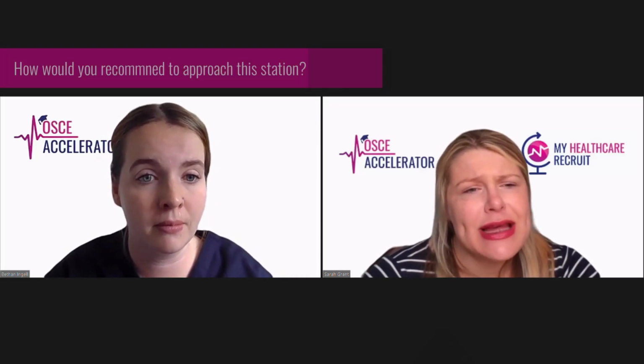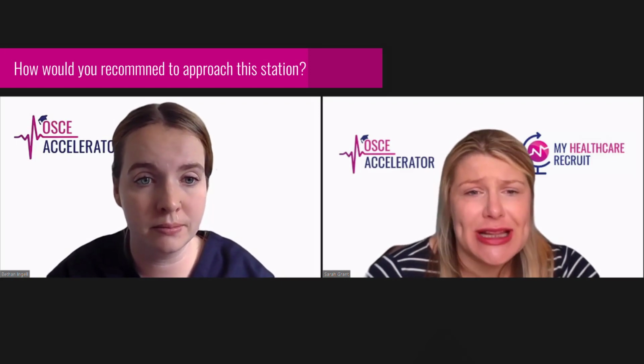And how would you recommend approaching this station, preparing for it as well as you can? Okay, so one of the things I would recommend doing is make sure you explain the procedure well. You're going to explain it before you give it to the patient, and then you've got to give 2 puffs. So I would recommend actually explaining it 3 times, once on each time, because in my experience, nurses get a bit stressed in the exam, and obviously you're going to forget things under the pressure.